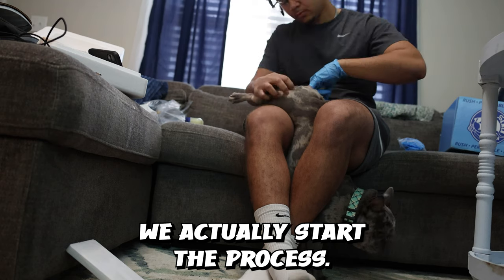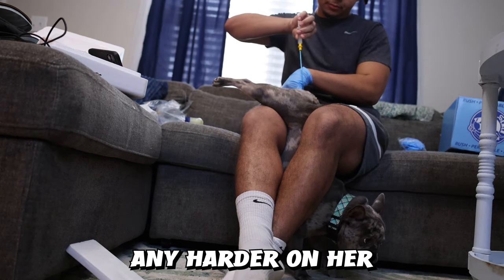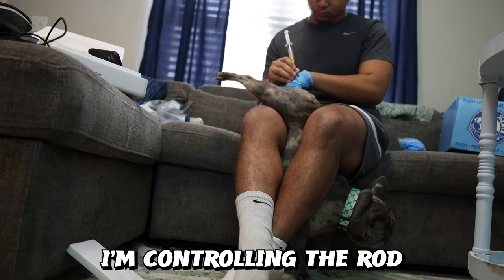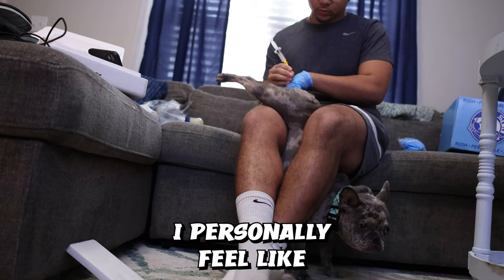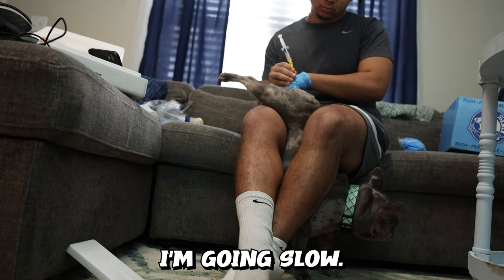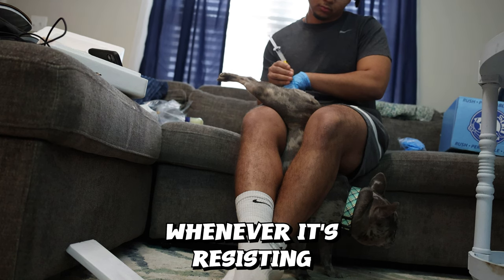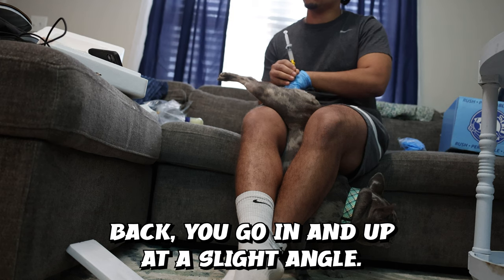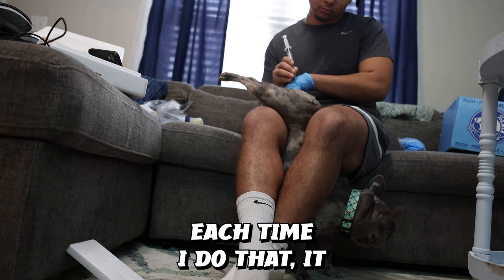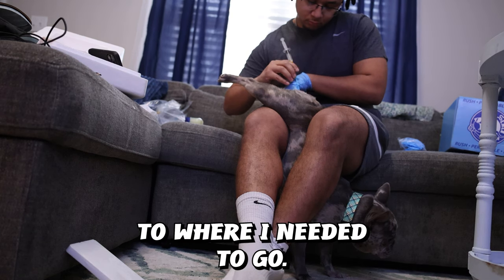This is where we actually start the AI process. I'm being slow and patient — you don't want to rush this. You don't want to make it any harder on her than it is because she's already uncomfortable in this position. I'm controlling the AI rod by holding the rod itself rather than the syringe, because I feel that gives more control. I'm going slow, twisting, going in and out — not pushing when it's resisting. You go in and up at a slight angle. I'm slightly pulling up and twisting at the same time, and each time that allows more space to go in. I can tell it's going where I need it to go.